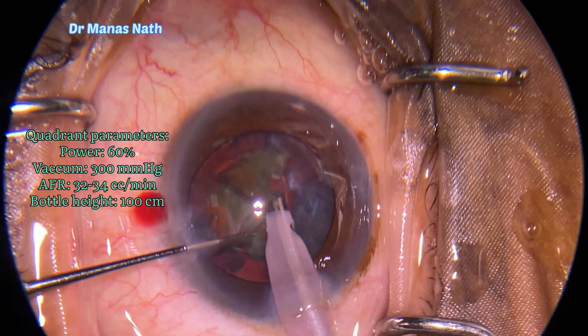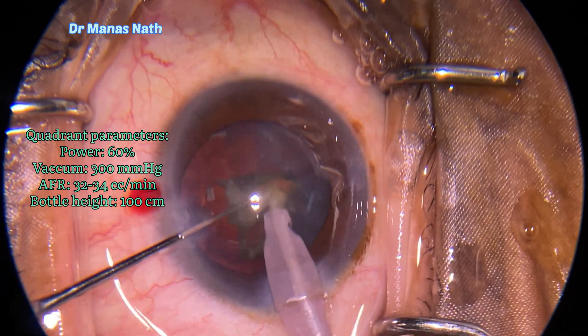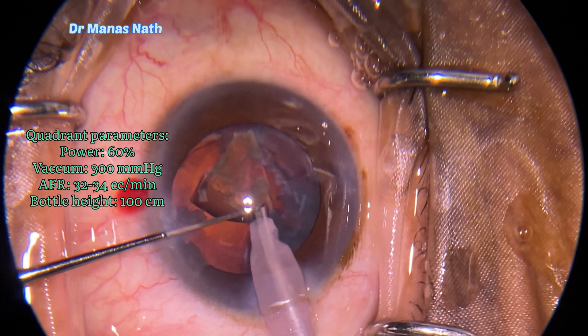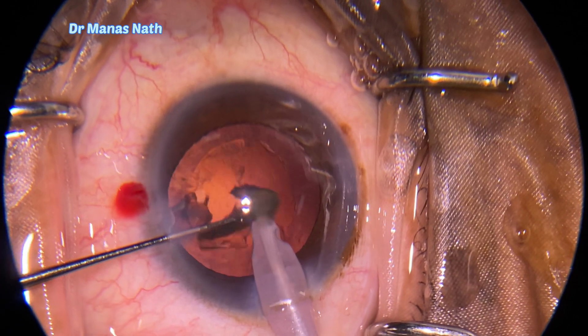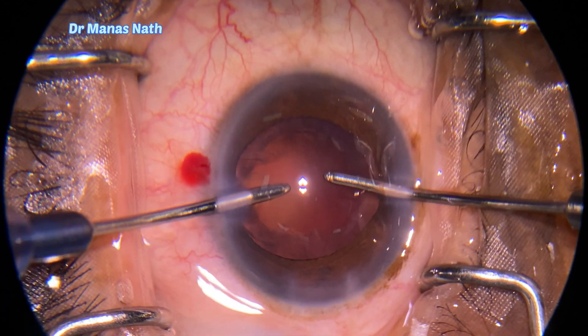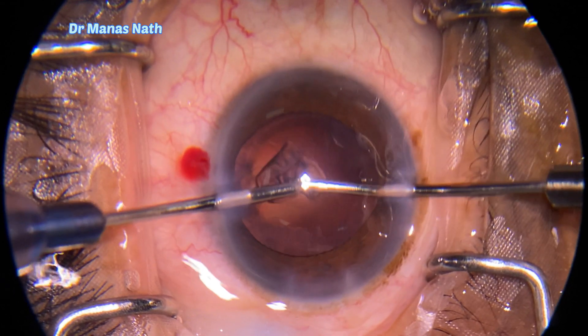I was lucky that it did not pierce through the posterior capsule. One should be very careful: when you are on high vacuum or high power, do not go to the periphery, because at the periphery the nucleus can be a little softer. After removing the nucleus, I'm doing bimanual irrigation aspiration.